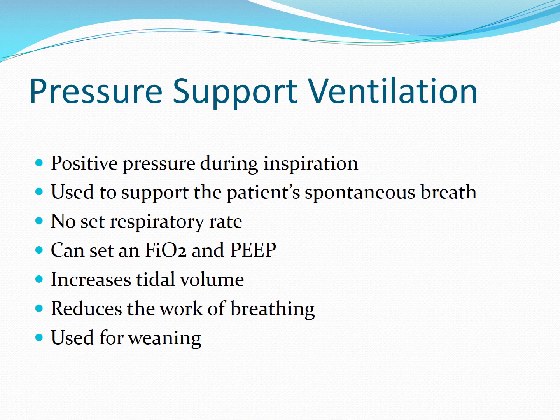So this is pressure support ventilation, and pressure support ventilation is just that. What this does is this allows positive pressure during inspiration.